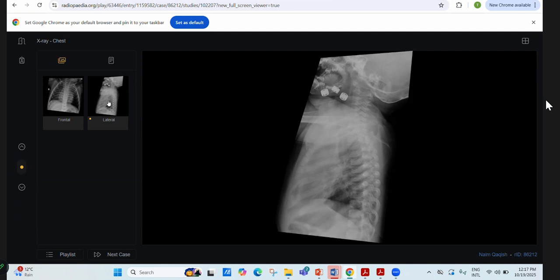If this is a foreign body aspiration, as you suggested, what should be the next step? Immediately inform the pediatric team on call, and this should be taken into account, and they should evaluate the patient and try to retrieve the foreign body by doing bronchoscopy.